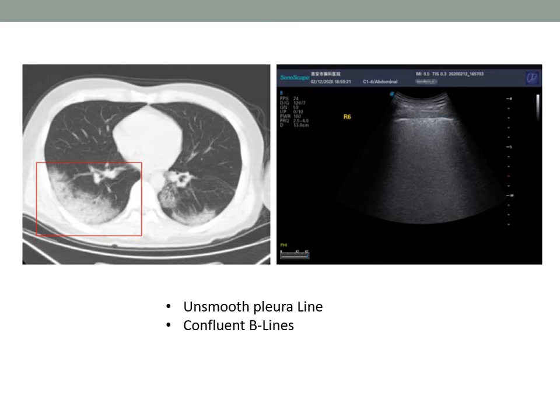So remember, it's all about lung water. Initially you'll get one or two B lines, and then you'll get multiple B lines, and eventually you just get the B lines coming together. One of my colleagues says it looks like the beam from a UFO about to abduct someone, but I think we're meant to call this waterfall sign instead. Do you also see how the pleural line is no longer smooth again?